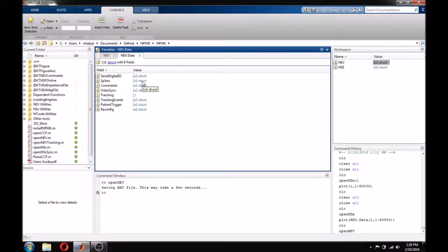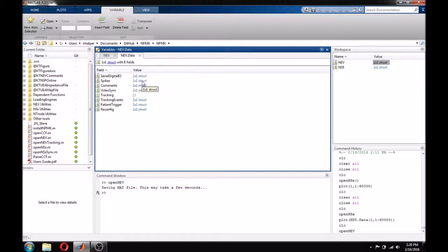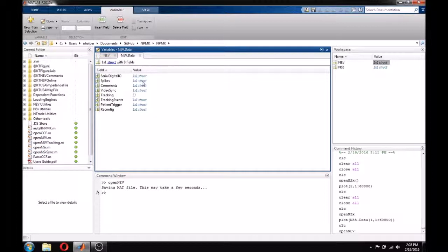As I mentioned earlier, NEV files stand for neural event files, and they contain everything that is not continuous data. This means that they contain spikes, digital inputs, tracking events, comments, and other event-based data that is used a little bit less often.